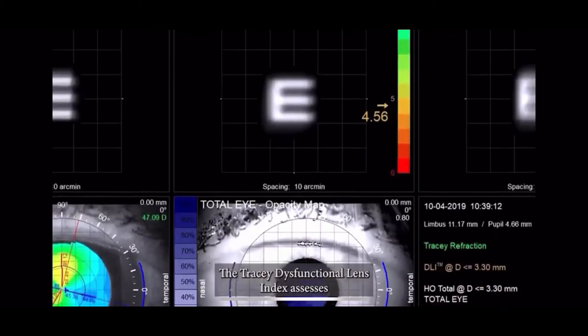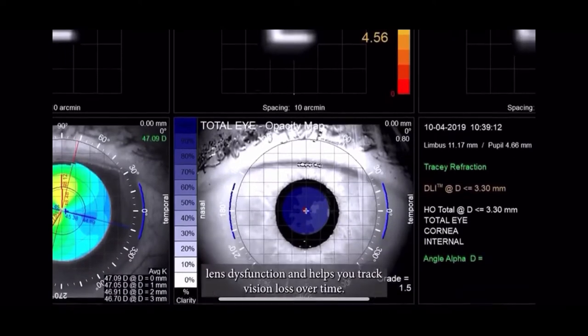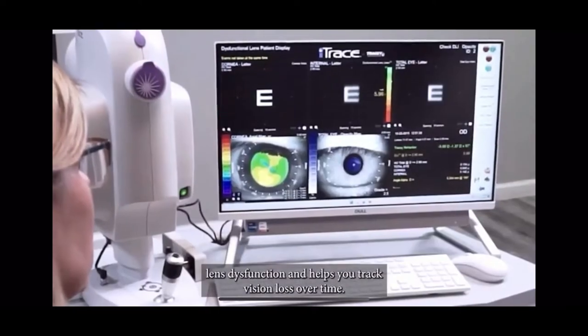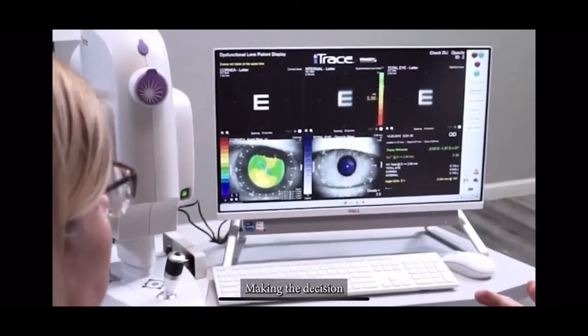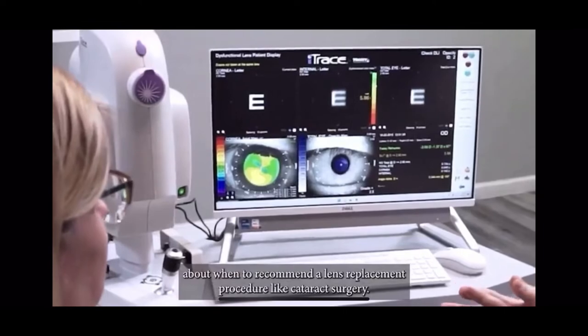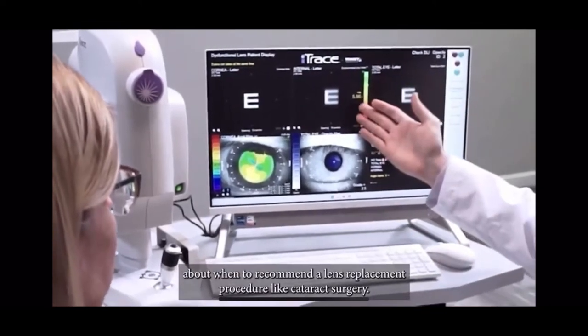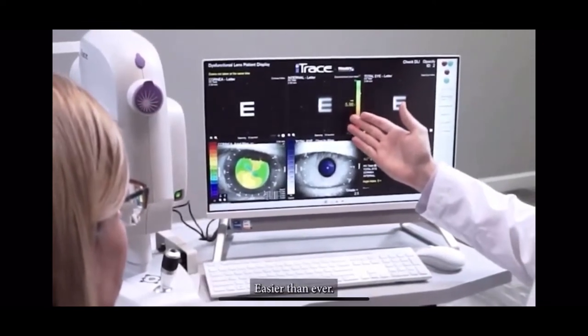The Tracey Dysfunctional Lens Index assesses lens dysfunction and helps you track vision loss over time, making the decision about when to recommend a lens replacement procedure, like cataract surgery, easier than ever.